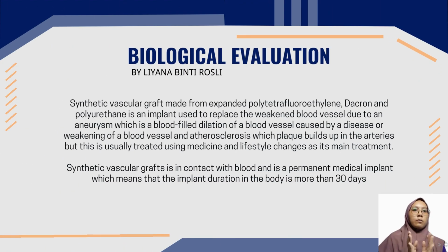Synthetic vascular grafts are made from polytetrafluoroethylene, Dacron, and polyurethane. These implants are used to replace weakened blood vessels due to diseases such as aneurysm, which is a blood vessel dilation caused by weakened blood vessels, and atherosclerosis, where plaque builds up in your arteries, but this is usually treated by medicine and lifestyle changes. Synthetic vascular graft is in contact with blood and is a permanent medical implant, which means that the implant duration in the body is more than 30 days.